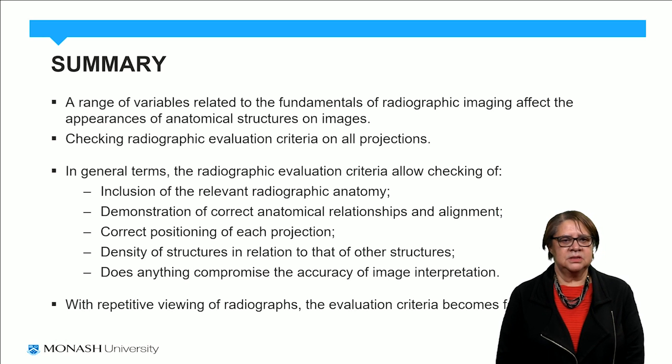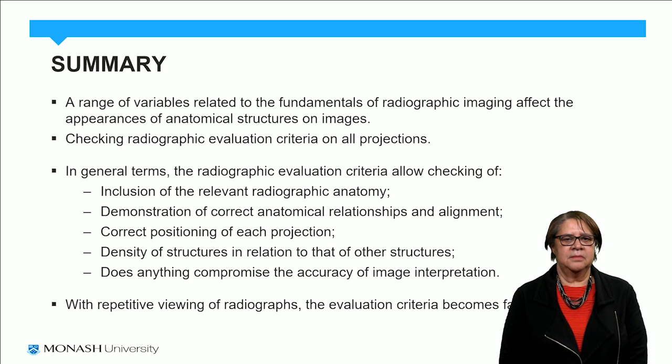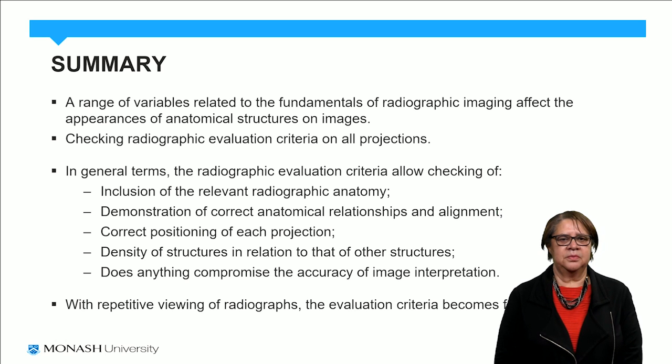The other important message is that the more you view radiographs, the more you will become more accurate in terms of identifying any of the pathology.